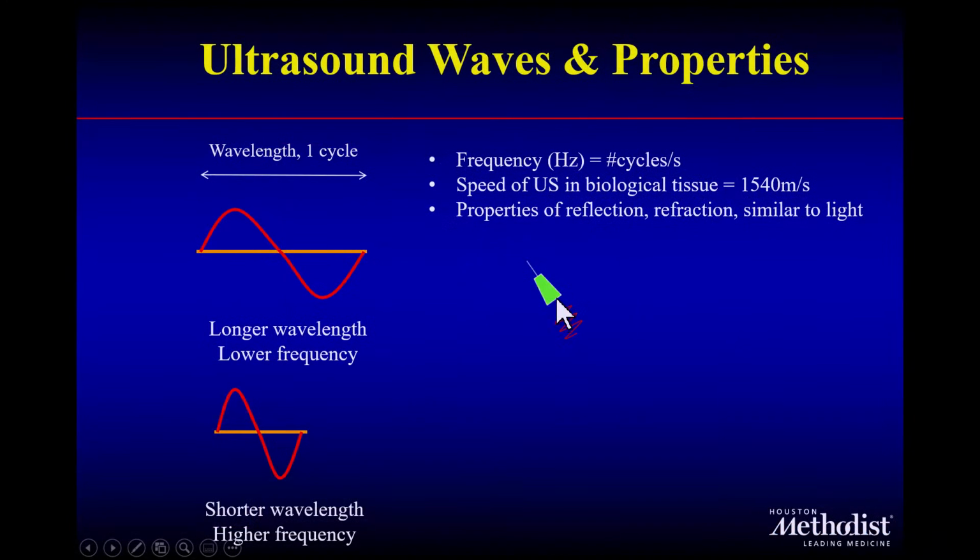So if you take a look at this ultrasound transducer, at the tip of it are piezoelectric crystals, that are either responsive to mechanical stimulation or electrical stimulation, and after you stop exciting them, they'll emit a burst of waves, and I think that's the beautiful property of them. And as you know very well also, for us to be able to send and then receive and listen to these, we usually send bursts as opposed to a continuous emittance of these waves.